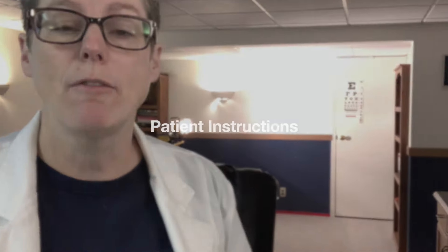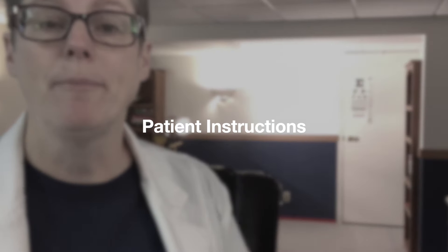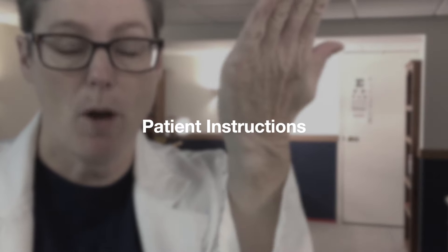As your patient is standing at the 20-foot line, you're going to be pointing at different areas on the chart and asking them to read the line you point to. We do it one eye at a time, so you'll want them to cover up their eye with either the palm of their hand or a piece of paper — not their fingers, because they can see through them and that might skew your results.